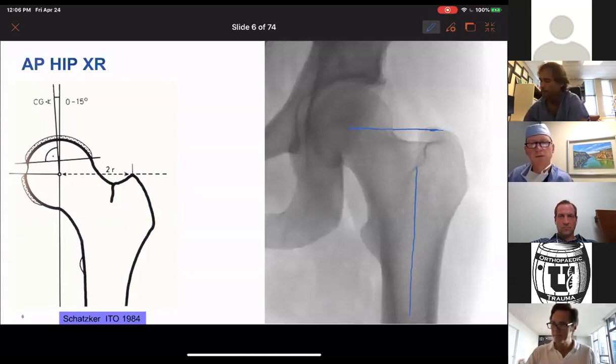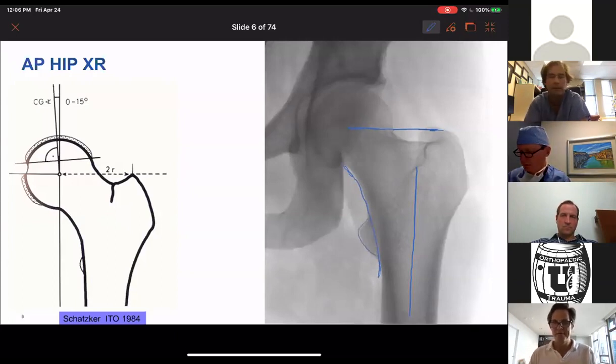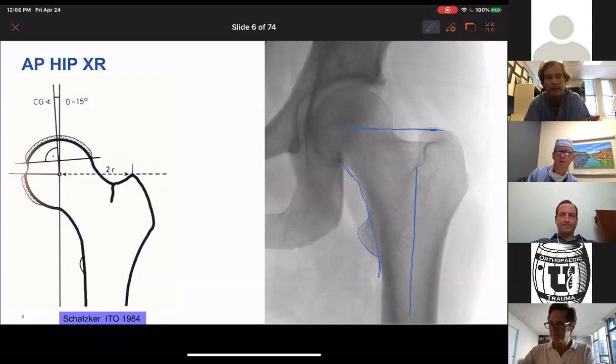Fourth, there is a particular relationship between the inferior aspect of the neck of the femur and the shaft. It is a smooth, unbroken curve. And the lesser trochanter, in varying degrees, will come out from that curve. I say in varying degrees because there's wide variability in the population as to the size of the lesser trochanter. So in and of itself, it is not a measure of anteversion. I don't think you can use it just for that. Now, if you have a fracture of the proximal femur and it is attached to one or the other segment, it can help you with rotation, but the size of it in and of itself can't tell you whether someone has 5 degrees of anteversion or 40 degrees of anteversion.